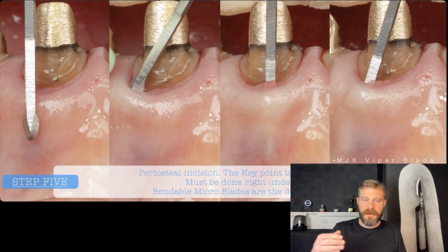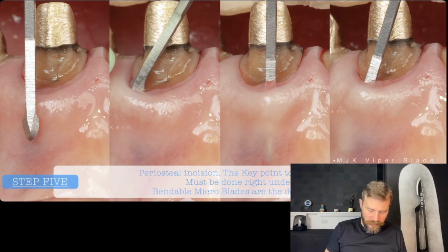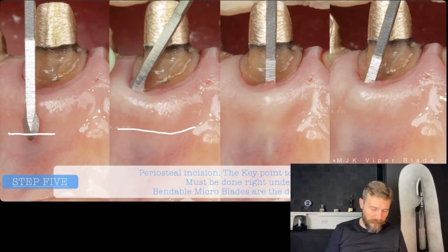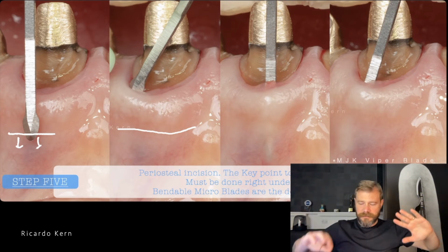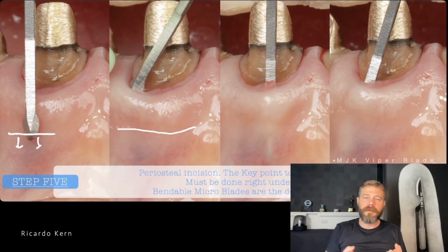Okay, so the microblade is going to go inside the flap until the mucogingival line, so until this area here, exactly as I'm pointing here previously. Of course, the instrument is not cutting anything, but from this level down, the instrument is going to need to cut the periosteum. Once I make a horizontal cut of the periosteum, of course, the coronal part of the flap is going to be free from the periosteum attachment, so we can move that more freely.